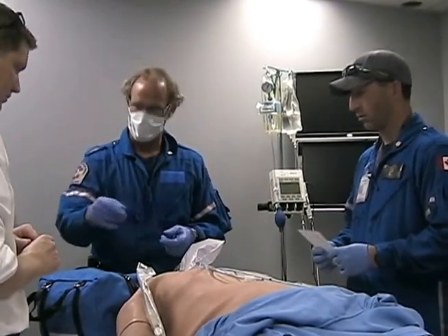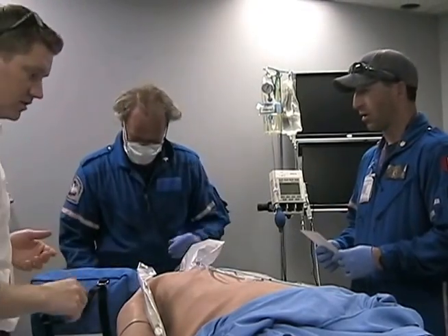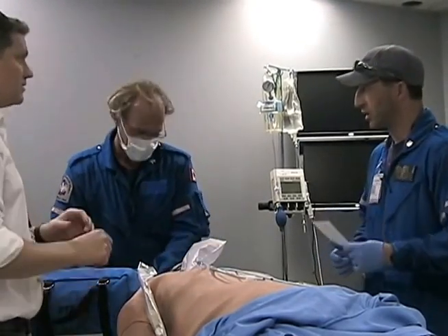Okay, and you did test the cuff, right? I did test it. Awesome, that's perfect, thank you. Okay, Bruce, good to go whenever you're ready for the checklist. Yeah, let's go ahead with the checklist.